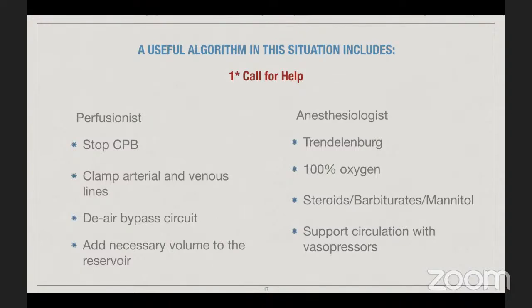Another source is the aortic root vent. The perfusionist can introduce air through it by mistake. Exactly, and this happened. I did not see it, but it happened in one of the centers that I worked in.